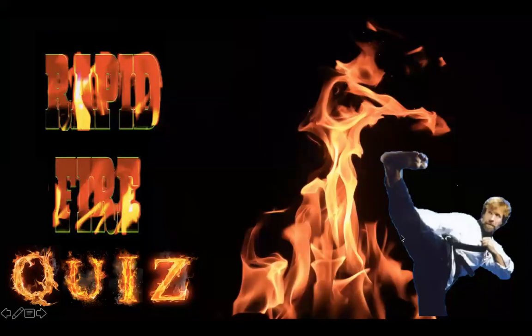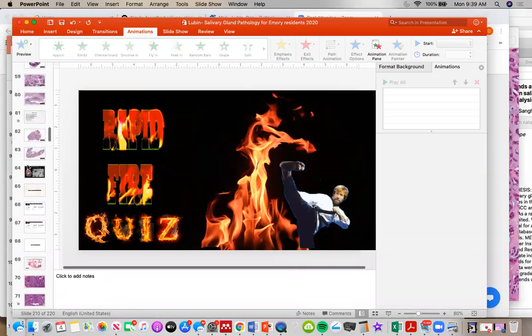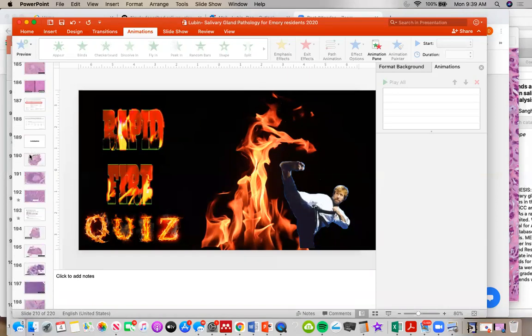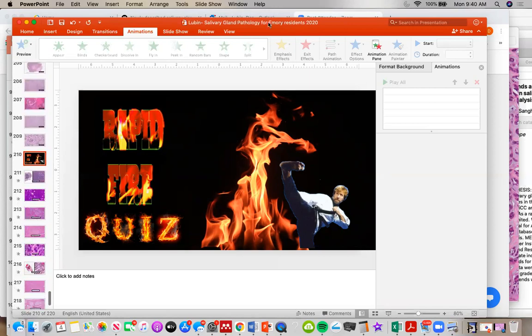All right, so I was going to do a rapid fire quiz. I just like this slide too, but because we're already over time, I'm not going to go through this little quiz of these random lesions. I'm going to share this PowerPoint with you guys so you can look at these images later. So I guess that's it. We have plenty of slides here and we can do slides some other time, but I really want to get through as much of the didactic as possible because there are just so many freaking lesions to talk about. So that's it.